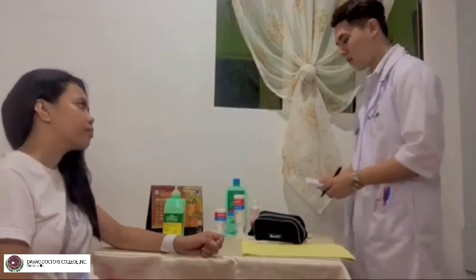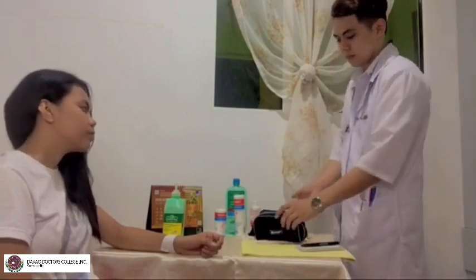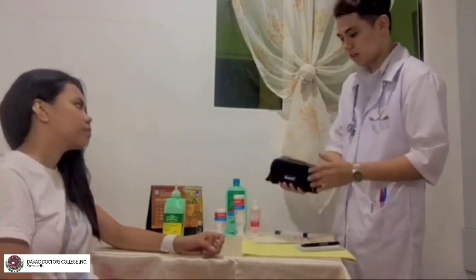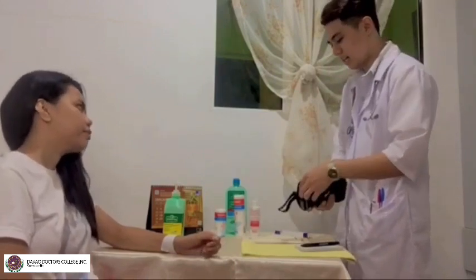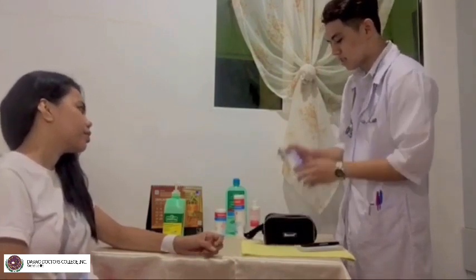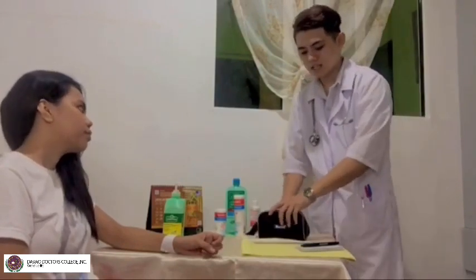Okay. So, karon di ay ma'am, kuhaan na ko imong vital signs, okay? Kuhaan na ko imong temperature, imong blood pressure, imong respiratory rate, or of course, your pulse rate. Gamiton po di ay na ko ni ma'am kaning stethoscope, kaning sphygmomanometer or the BP apparatus. Nakakita na ba ka ni ma'am? Yes. Sige. And also, ma'am, the usual thermometer, okay? And the cottons and all.